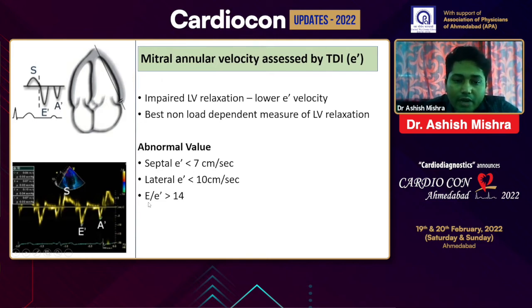And in fact, the E/E' ratio, which again reflects the pulmonary capillary wedge pressure or the LV filling pressure, with a ratio more than 14, would go on to suggest the presence of LV diastolic dysfunction.